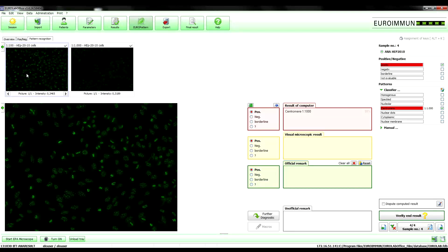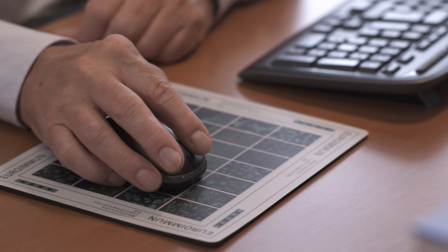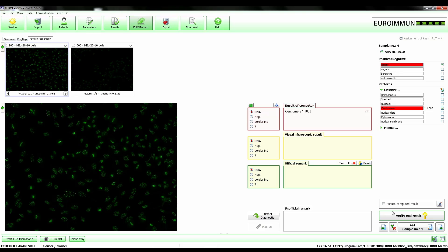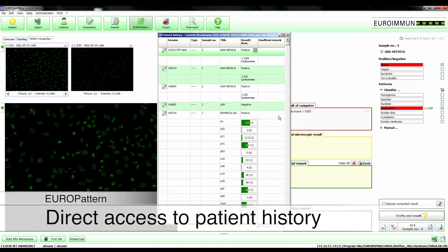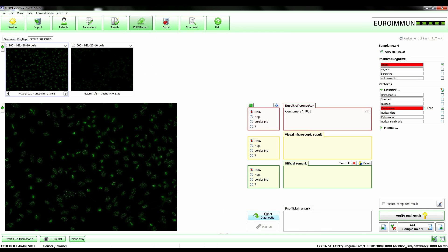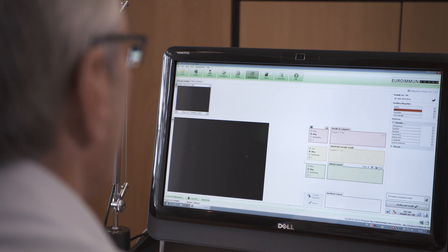For comfortable and safe diagnosis, images of multiple dilutions of one sample or multi-parametric tests are automatically combined to one report by the software. The laboratory physician has direct access to the patient history and subsequent investigations can be directly requested from the results screen.